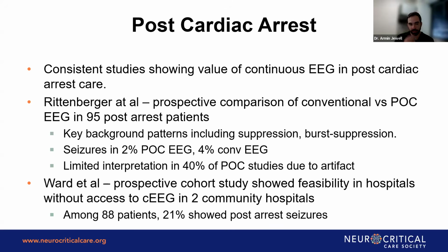But again, similarly to the last point that I made, if this is what is available in hospitals without access to continuous EEG, there is still some value. Even among the patients that they screened with point of care EEG, they did show some post-arrest seizures, so that helped modify their treatment plan.